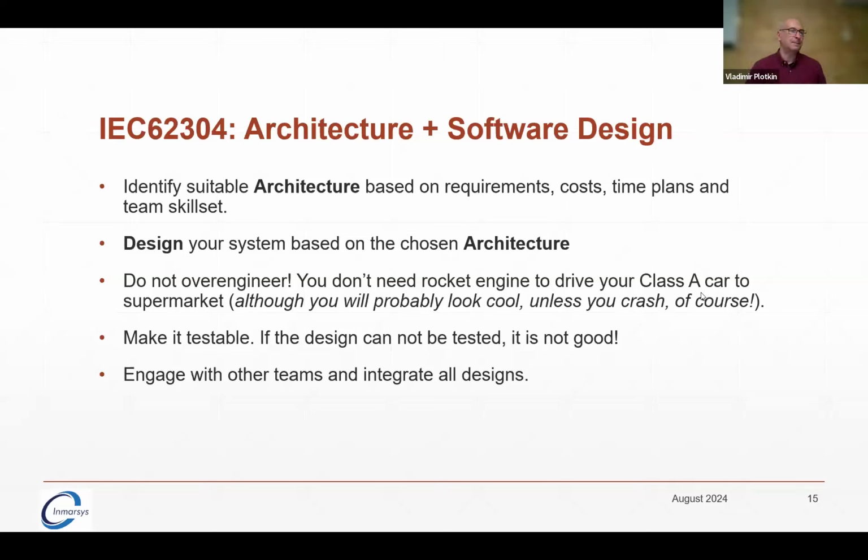So, for example, if you have a medical device which is, I don't know, a lateral flow reader, for example, or a blood glucose meter, they'll probably have some sort of microcontroller which will run firmware, and you have this as a software item. Then this blood glucose meter is connected to, say, PC software to display analysis. That's going to be a different software item, which can still be part of the same software system. So that's how you partition the system.